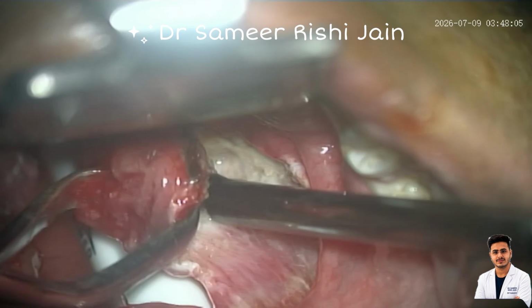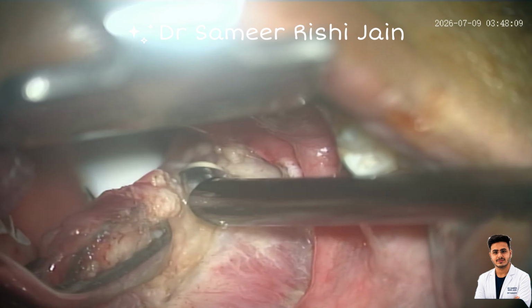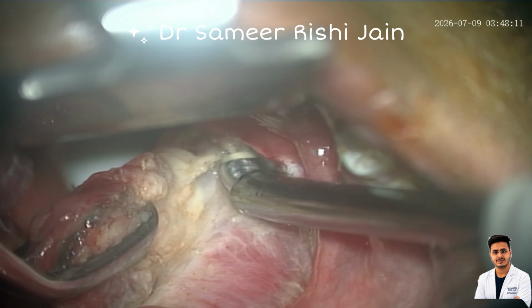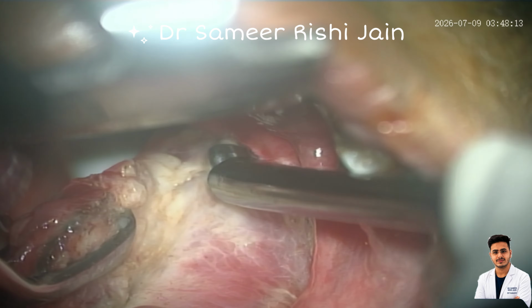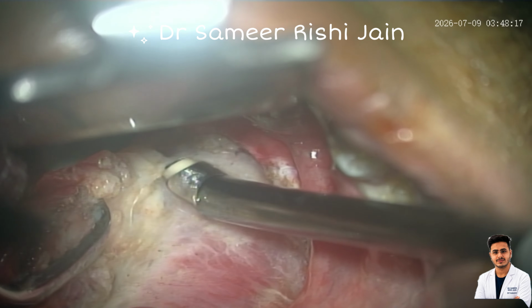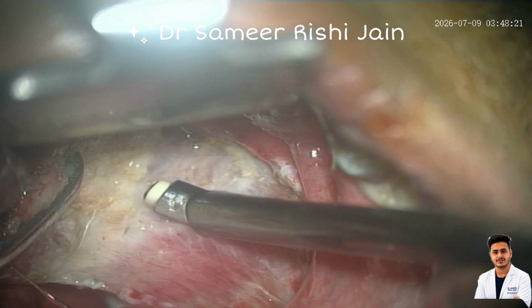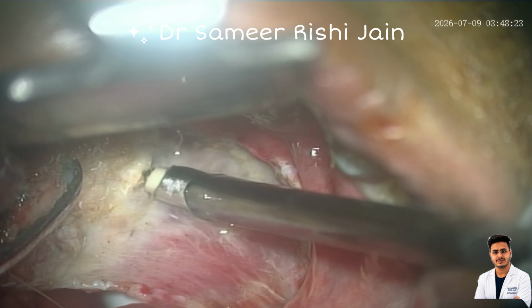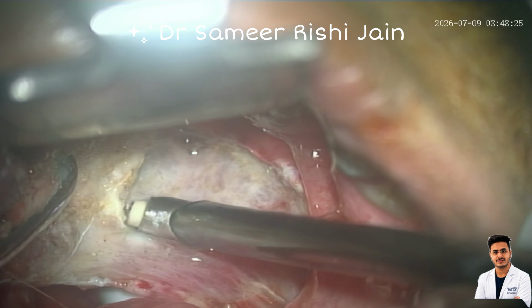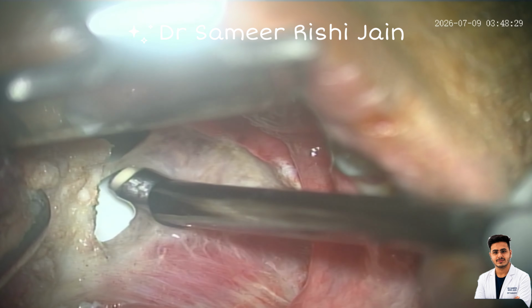The movement of the wand and the speed of the wand should be optimal. If the movement or the speed of the wand is too fast, the ablation mode will not coagulate the little bit of the small vessels which are present, and if the movement of the wand is too slow, it will cause the charring of the tissue or the burning of the tissue. The speed at which you move the wand should be optimal.